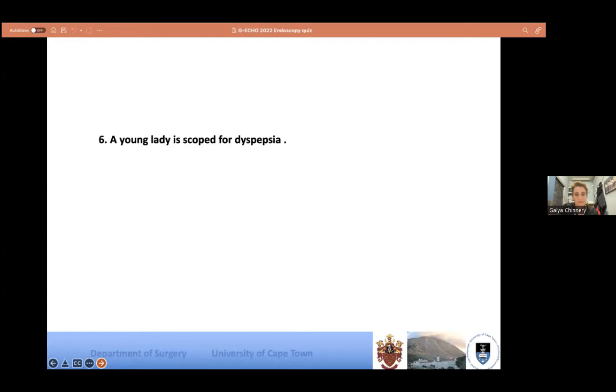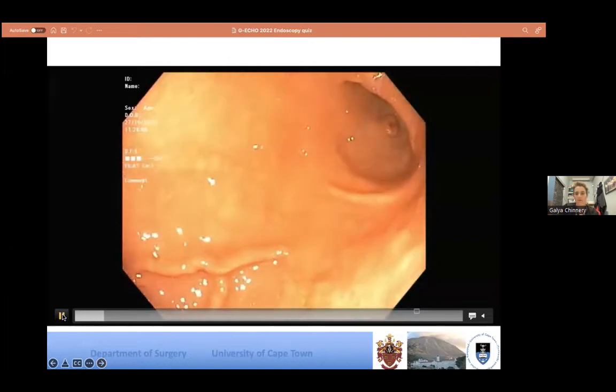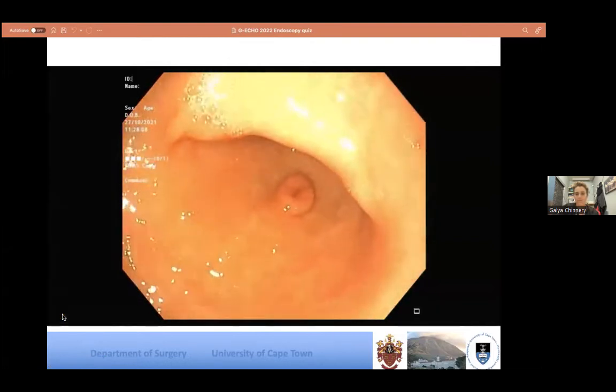Okay. Here you scope a routine young lady for dyspepsia. I'm going to show you the video quickly. And you go down towards the antrum, and this is what you see.